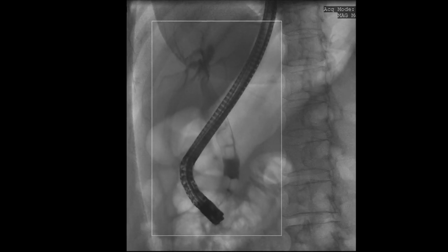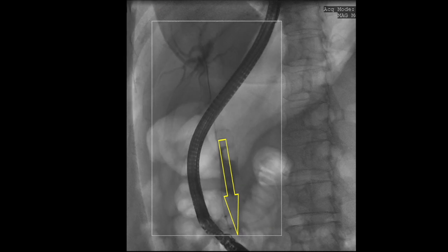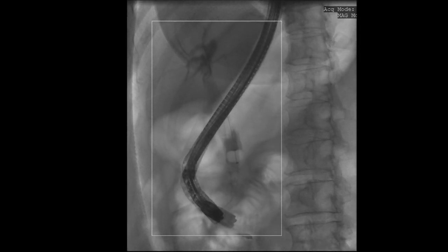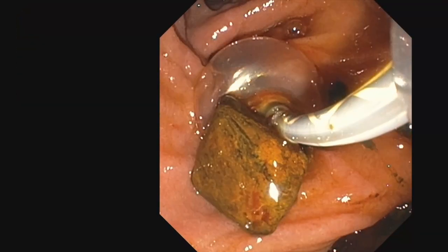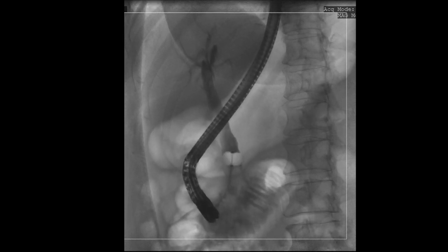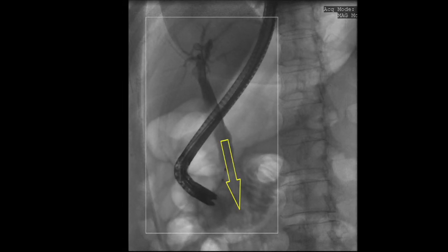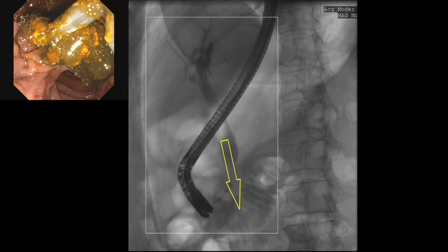Stone extraction is then performed and must begin with the distal-most stone. The technique involves positioning the fully inflated 15mm extraction balloon above the stone. The big wheel of the duodenoscope must be fully deflected down, then the duodenoscope must be torqued clockwise and gently advanced inwards in the axis of the bile duct. The objective is not to pull the stone out, but rather to have the balloon and the duodenoscope extract the stone using its own gravity. This prevents balloon tears and minimises the possibility of ductal perforations.